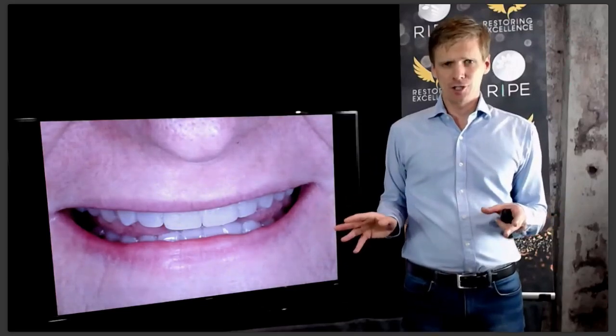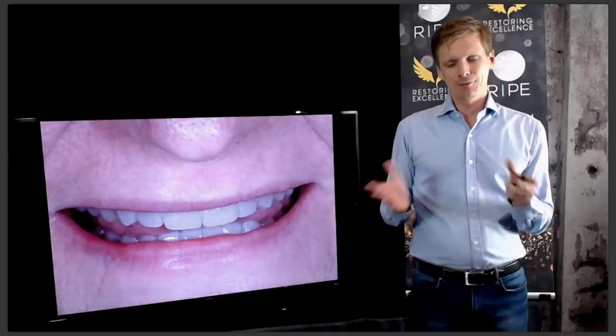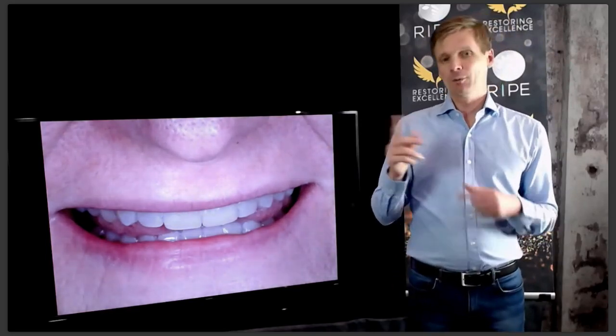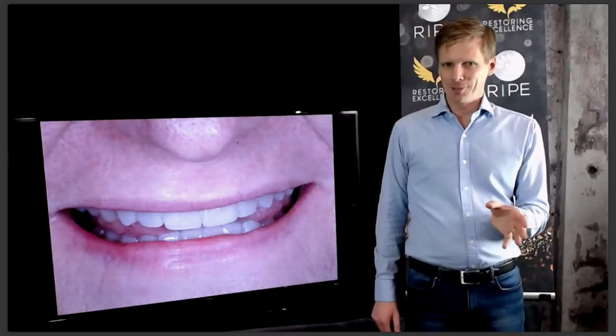This is a thing known as judgment, okay? You need to put them where they look good. There's no rule, okay? There is a rule which is roughly from +2 millimeters to -1 at rest, but there will be people who fall outside of that, and they're the ones you never get caught out by the patients who are normal.